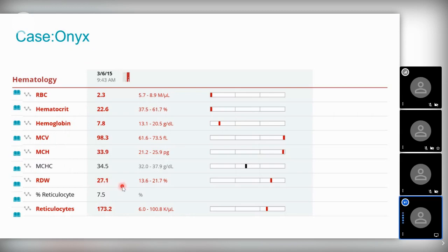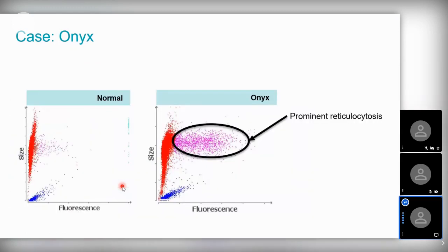Those fragments that we saw below were there, and you could see the red blood cells. Let me move to the graph again. So you can see the variation of cells from here to there. That means there are different sizes of RBCs present here. That is reflected in RDW. The reticulocytes are high in number, not very high, but they are high in number.